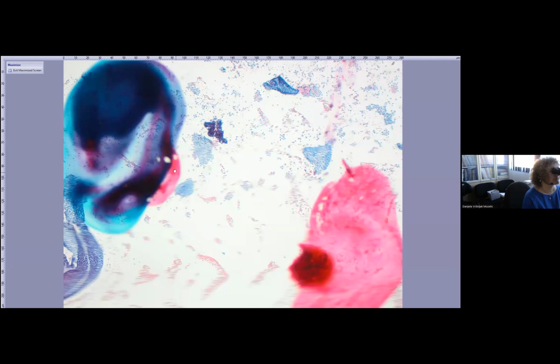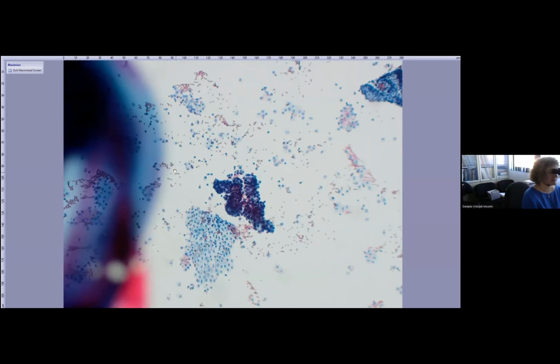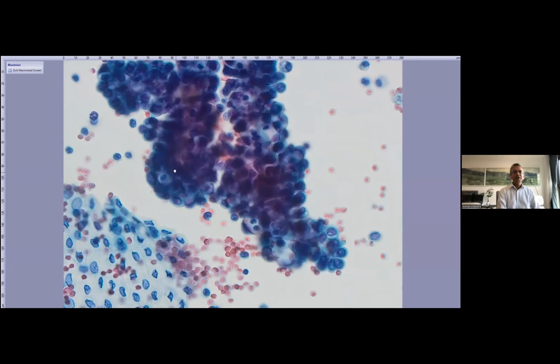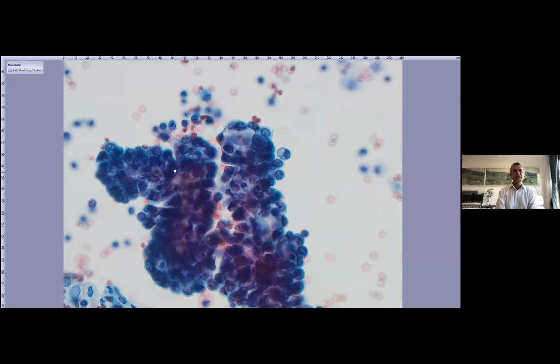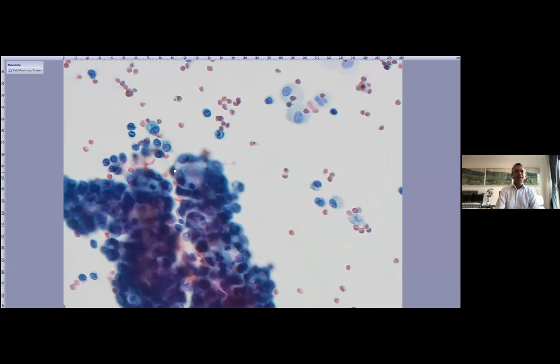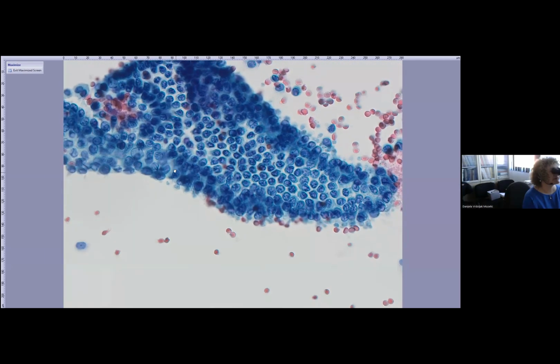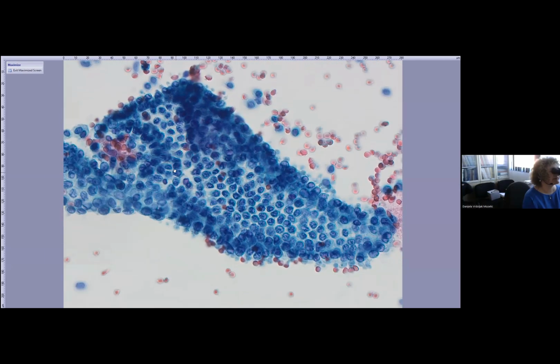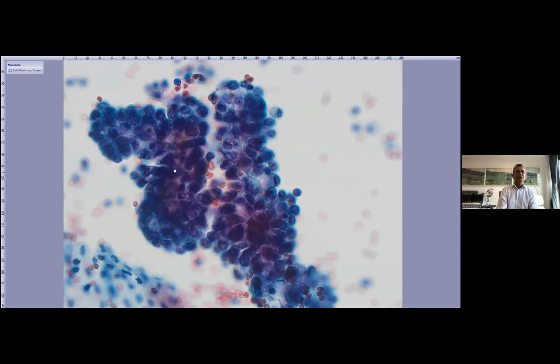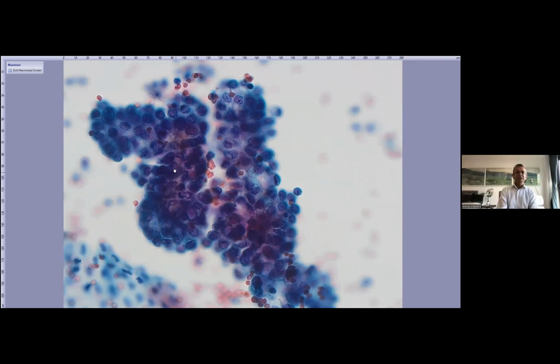So excellent. And when you compare, this is mesothelium. I think just recognizing the two separate cell populations is central to this. Otherwise, they could be missed completely. But when you see them next to each other, you see the difference. This is mesothelium, the flat, yes. And this then is the more three-dimensional nucleoli. And of course with the psammoma bodies.